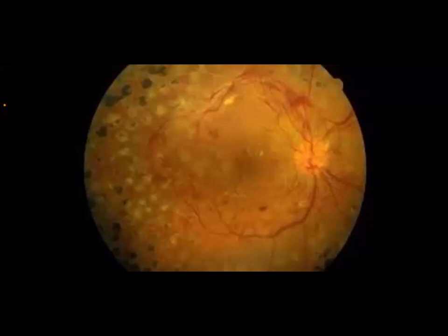Again, ask him, did you do any other procedure? Did you do laser therapy before? It is very important. He will tell you, yes, I did laser therapy. You will enter the retina. This black color cannot be for retinitis pigmentosa.